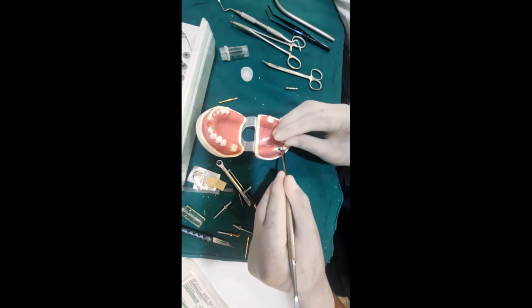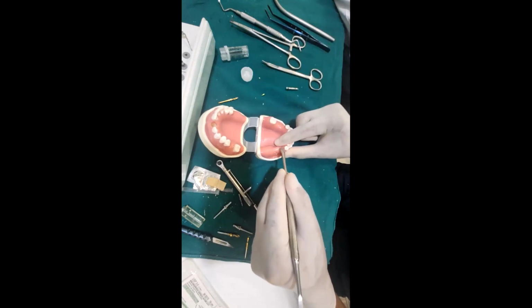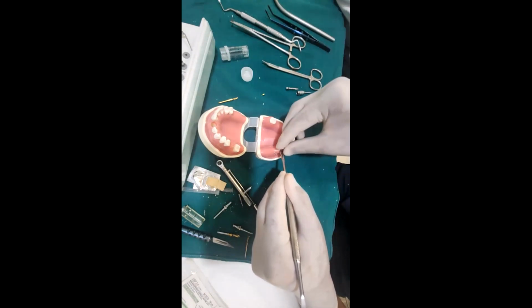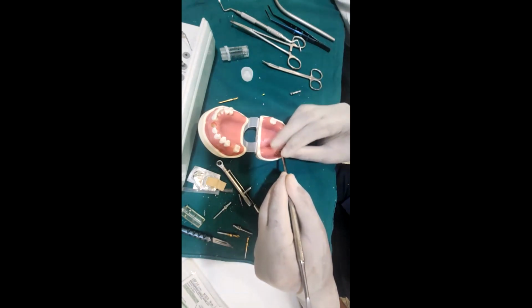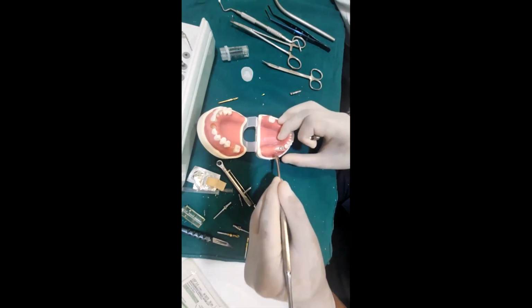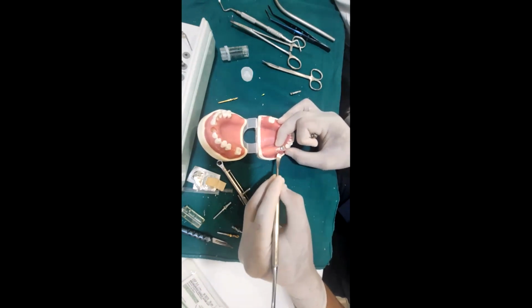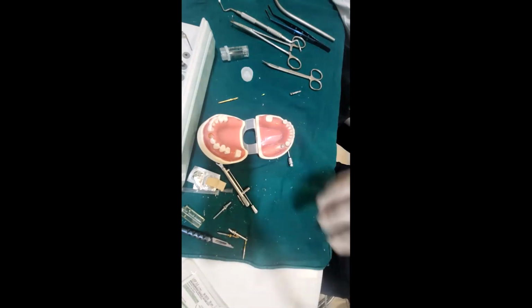In the second stage, you don't need to create such a big incision. You can just manage with a small cut or a cross cut to ensure that you have separated the mucosa only enough to expose the cover screw, remove the cover screw, and then have a healing abutment, as I had mentioned, which is at the surface of the mucosa. This will allow a good soft tissue to form around the implant prosthesis when we are about to do the occlusal loading.